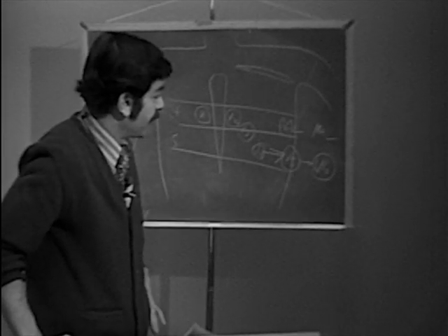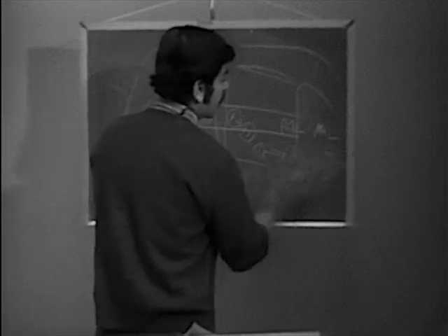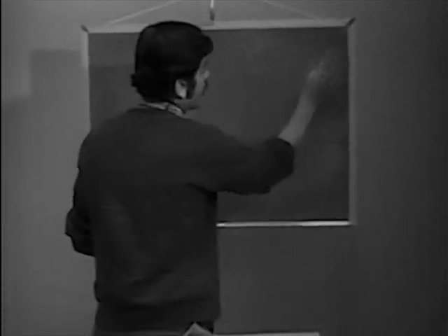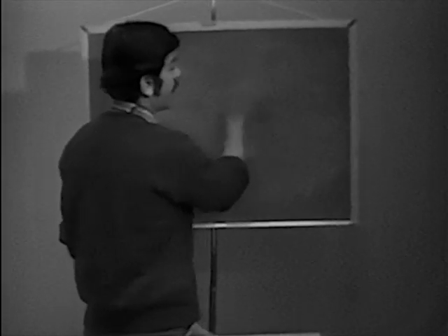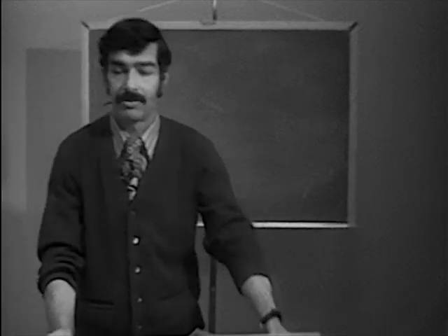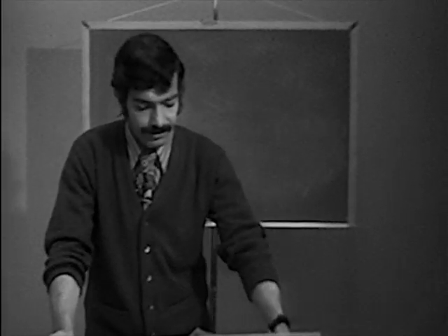Okay, so that's fairly straightforward. But it's important that everyone try to record the electrocardiogram in exactly the same way. Otherwise, we might have apparent changes which are really not due to what's going on in the patient, but just due to misplacement of the leads.